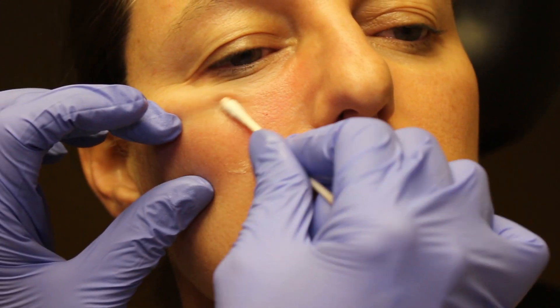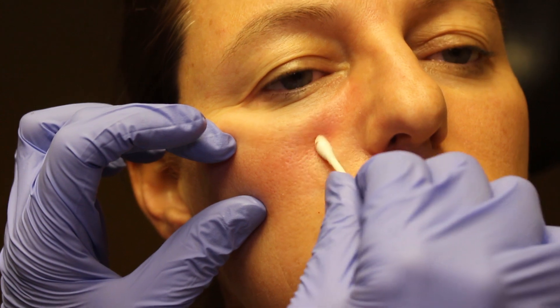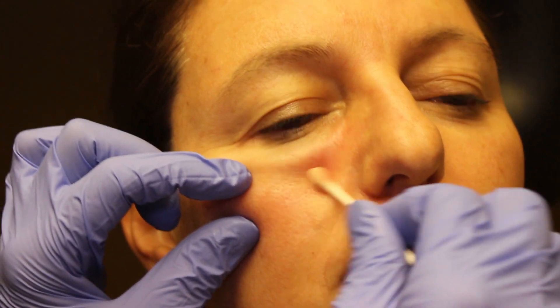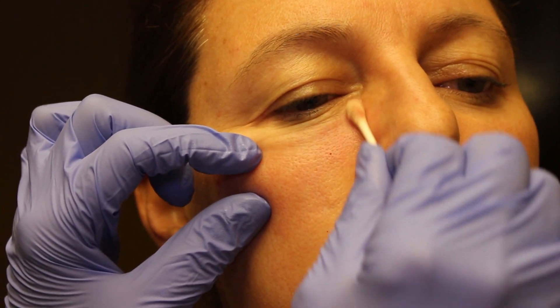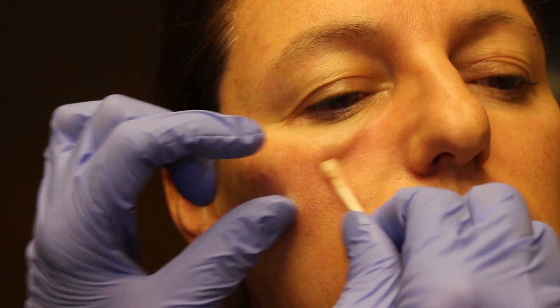I tend not to overfill — I know some people get carried away and end up looking a little buggy. It's not a good look. We want very natural, no bugs. I want a natural look here, just a little rejuvenated. This is one of the fat pads that we tend to anatomically lose over time — we're just augmenting that. It's a very nice and smooth look and it doesn't look like we did anything. Perfect.